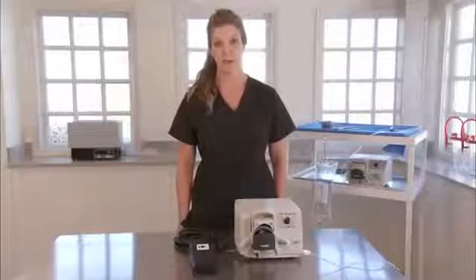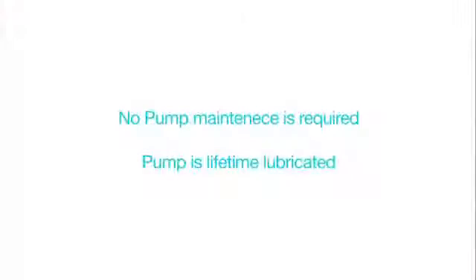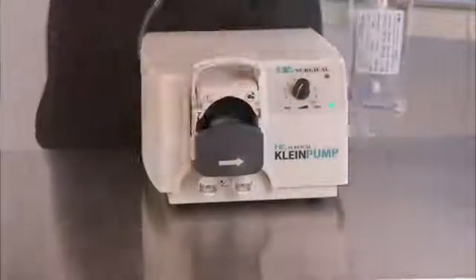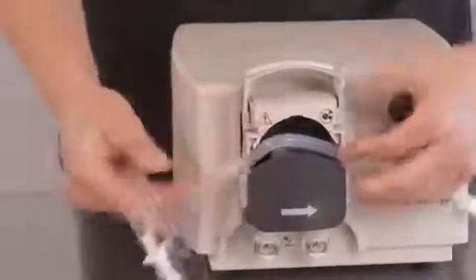Problem: fluid and air is pumping back into the IV bag. Possible cause: the tubing has been installed incorrectly. Solutions: remove the tubing from the pump head and reinstall the tubing, making sure that the spike is on the left when facing the pump.